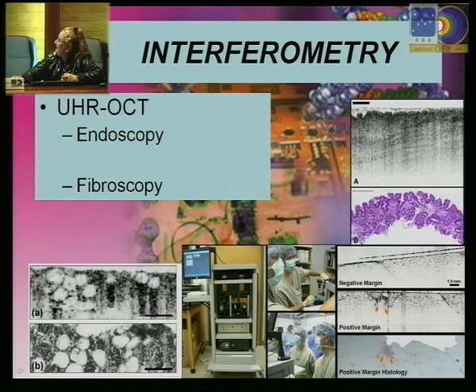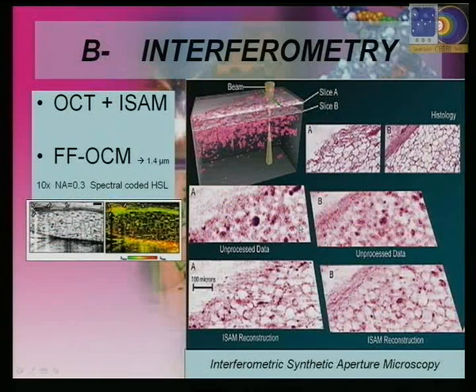It is clear that the quality of the images you get cannot be compared with the confocal microscopy we have seen, but on the other hand, particularly for internal organs in fibroscopy, you get images that are quite similar to the microscopic ones, and therefore they have sufficient quality for making a diagnosis, particularly when you are looking at the sentinel lymph node, whether it has neoplasia or not, in order to proceed with the surgery.